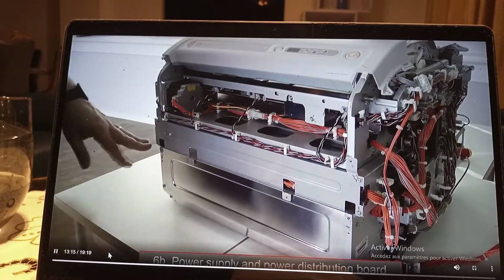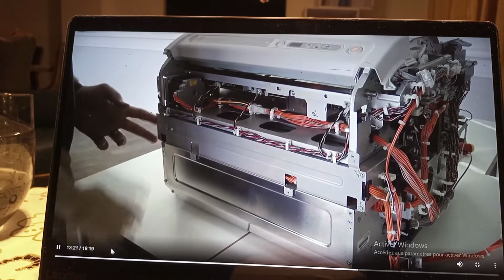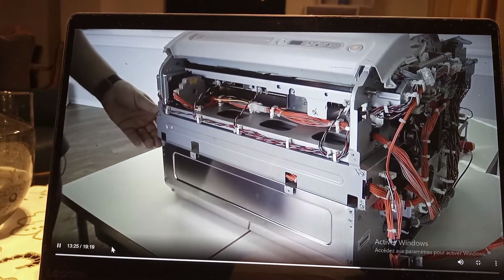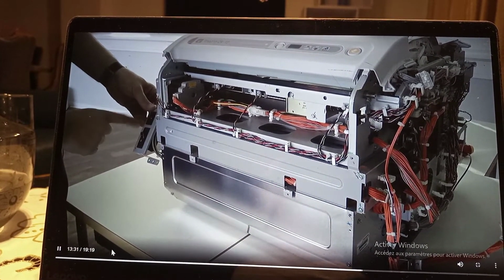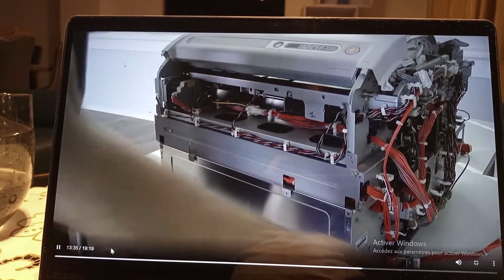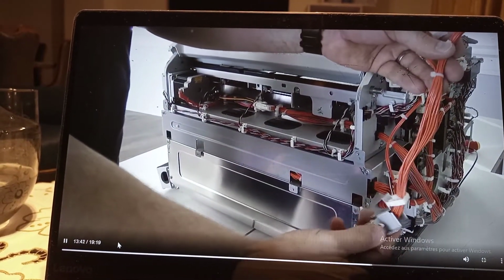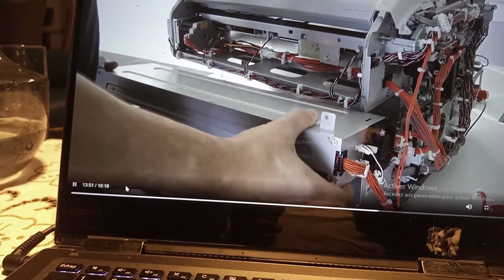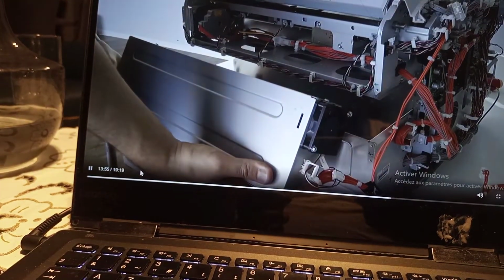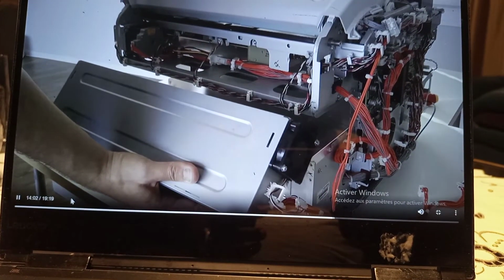For changing the power supply and the power distribution board, we need to remove the compartment where both boards are inside. So first of all, remove 3 screws to remove the power socket and the main switch. Then on the right side, remove the cable to the CPU board and the sensor board. Disconnect it, unscrew these 4 screws, and after that you can remove the complete compartment. This can be opened with 2 other screws, and then the main boards can be changed.